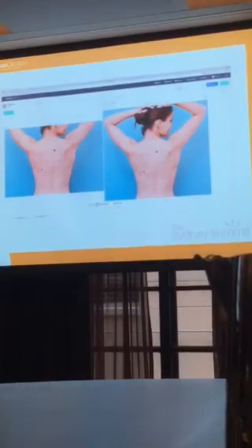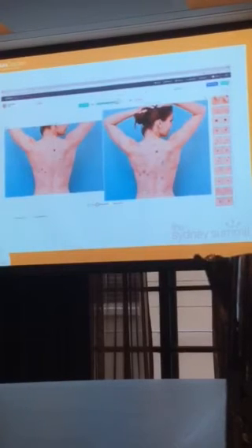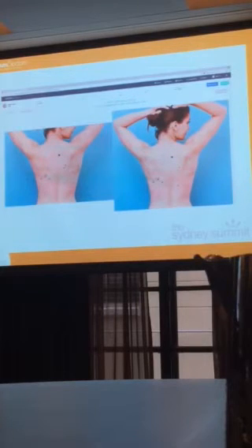The mole match feature automatically detects and matches all lesions in both images. The slider can be used to show fewer or more pairs of lesions. Matched lesions are listed on the right to simplify the reviewing process. Clicking on one location on an image will highlight the corresponding point on the other image. The lesion pairs can be edited or deleted, and new pairs can be added as desired.